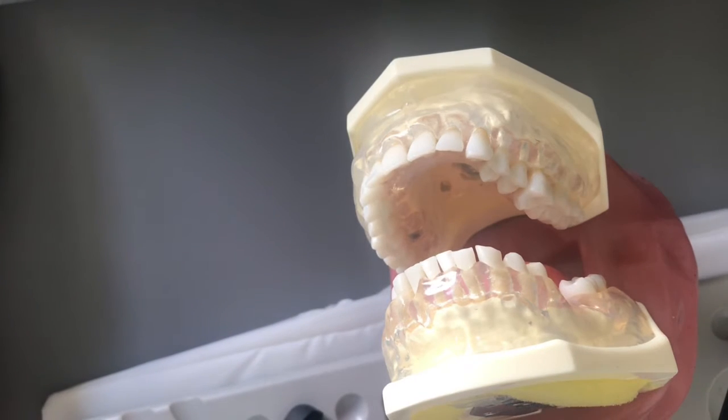Hello, this is Alyssa Gertman and I'm here doing my 15-16 Gracey Evaluation. To start off, I'm going to be sitting up straight with my loops on and we're going to get started.